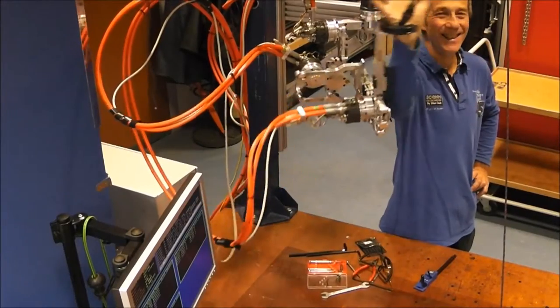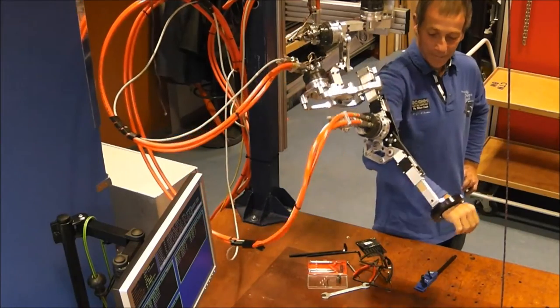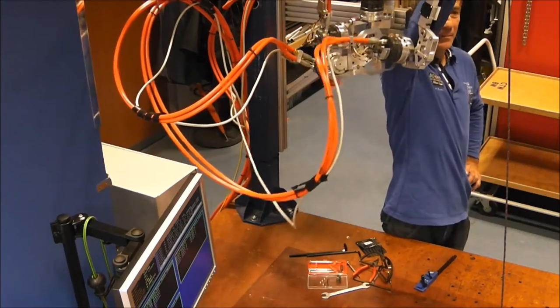The LIMPACT is operating in zero torque mode and it compensates for gravity. Our technician is showing how easy it is to move while you're attached to the LIMPACT.